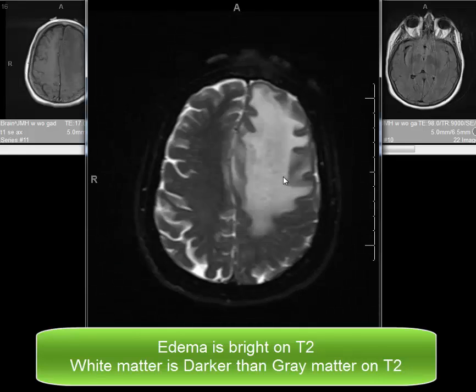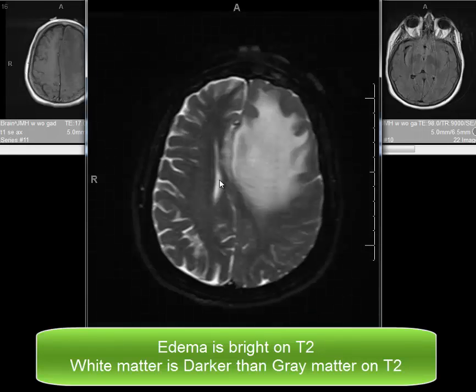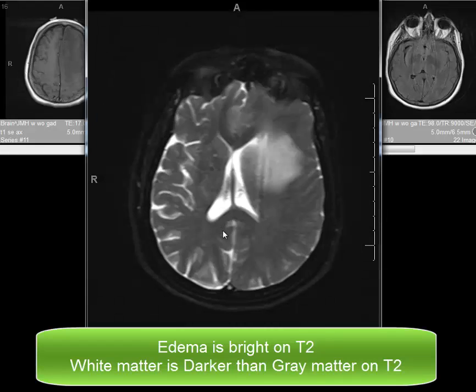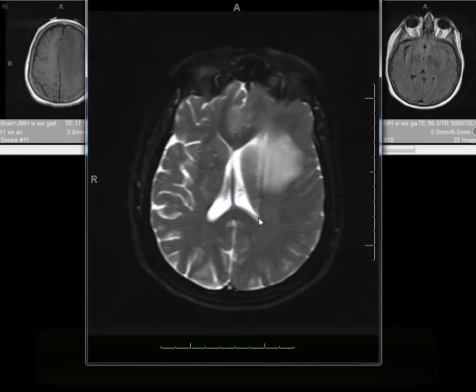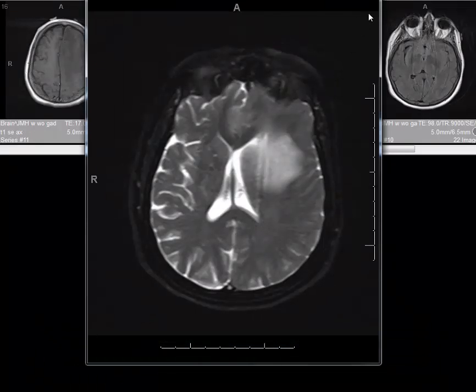Edema is going to be bright on T2. The white matter in this sequence is lower in signal than the gray matter. This is very good for pathology, and it has a long TR and a long TE.